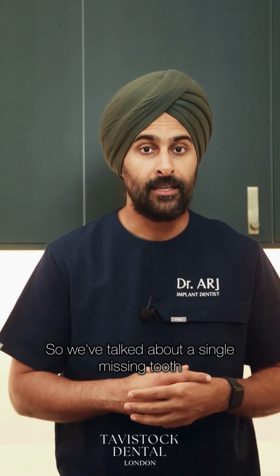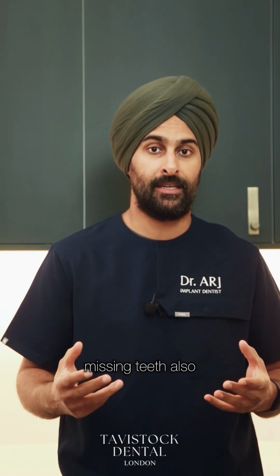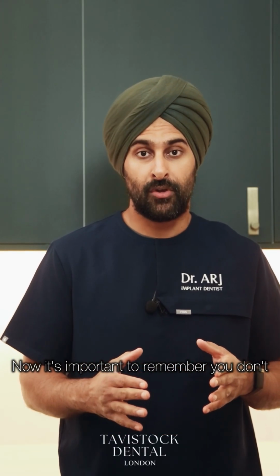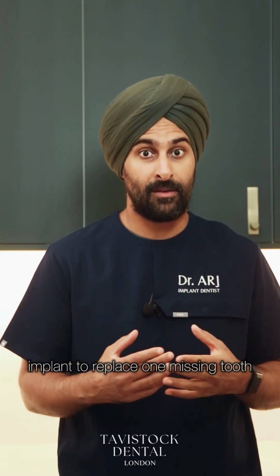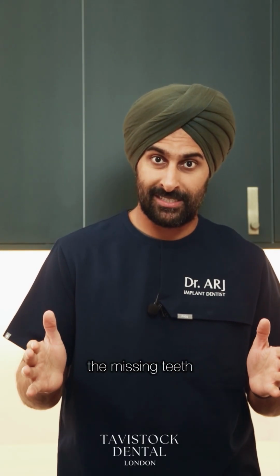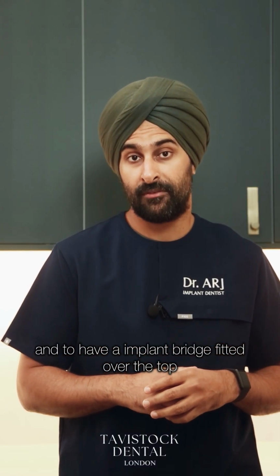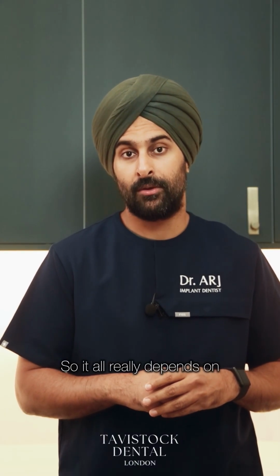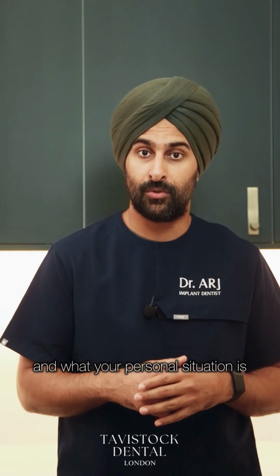So we've talked about a single missing tooth. Implants can also be used to replace several missing teeth also. Now it's important to remember you don't always necessarily need to have one dental implant to replace one missing tooth. So if they're all adjacent to each other, the missing teeth, it can be possible to place an implant at either end of the space and to have an implant bridge fitted over the top. So it all really depends on where the teeth are and what your personal situation is.